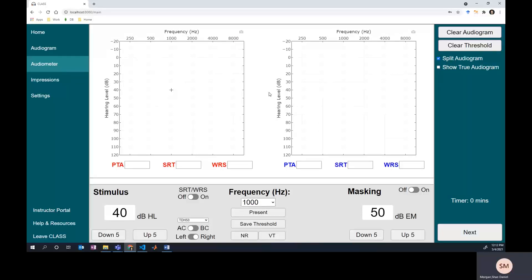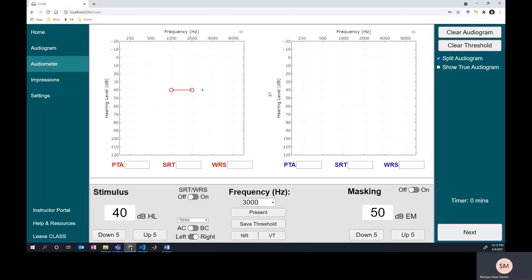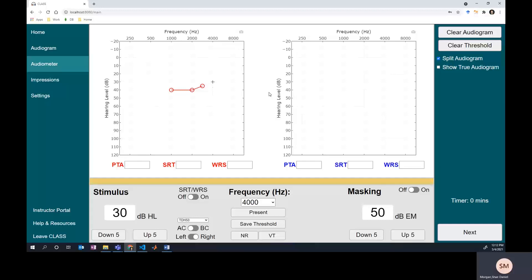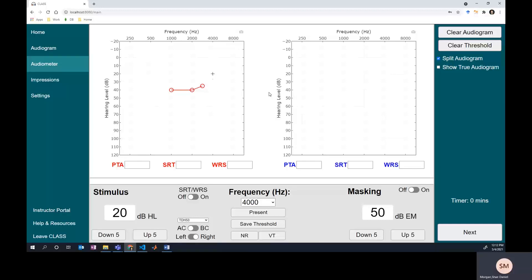I don't know if there's a better hearing ear, so I'll just go down by 10 and then up by 5 until I get a response. Confirm that response — on our way in the right ear. The program requires testing at 3k and 6k, so that's what I'm doing. You can toggle that off in the settings if you don't like that.